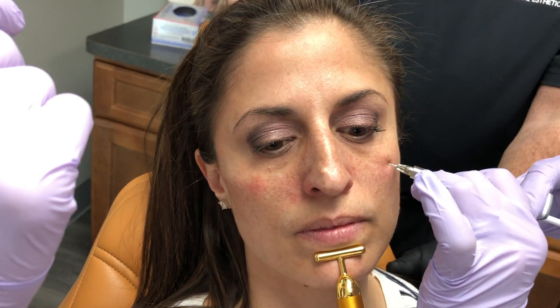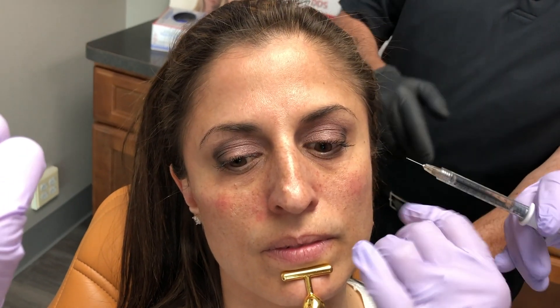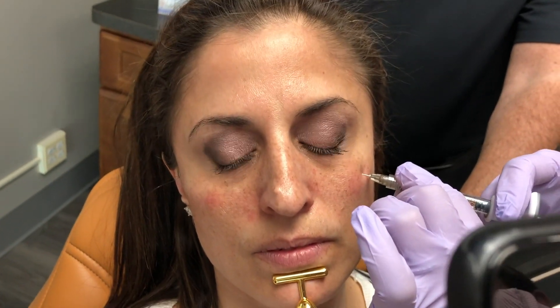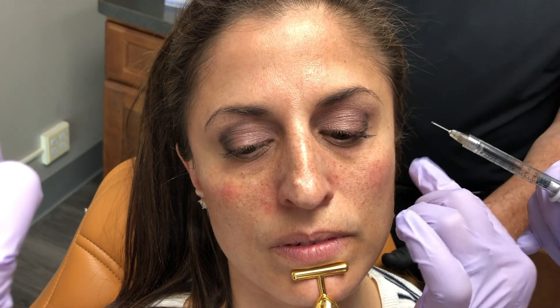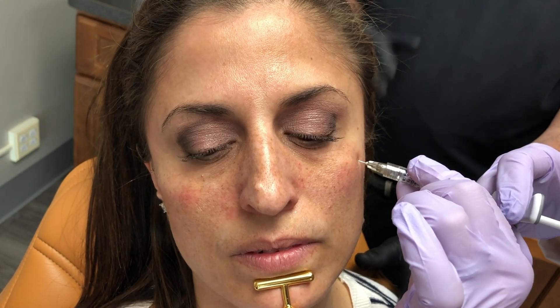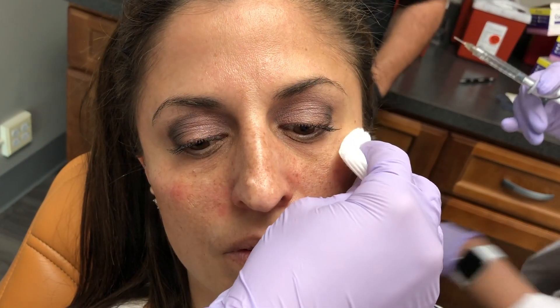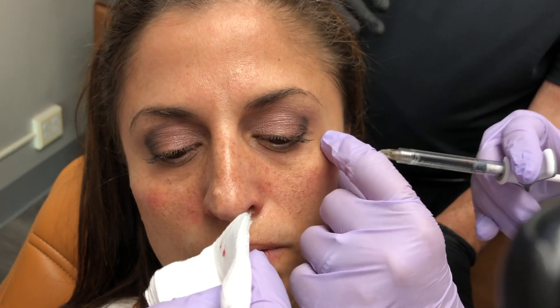Jill is starting more in the anterior malar region and she's going to follow along the zygoma — do not try this at home unless you've been trained by the AAFE. Because Jill is more of an advanced injector, we actually mark the patients up to really show you where the apex of the cheek is. Once you're more advanced you don't necessarily need those markings. Jill is using the AAFE safe injection perfection technique — she's going down, touching the zygoma, and pulling up just a little bit.